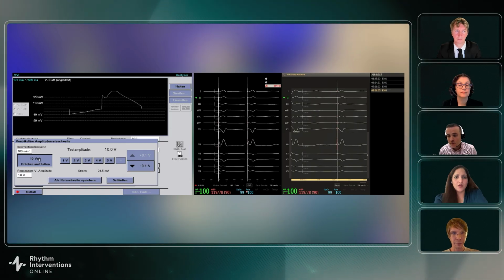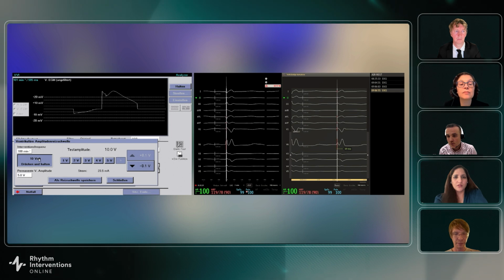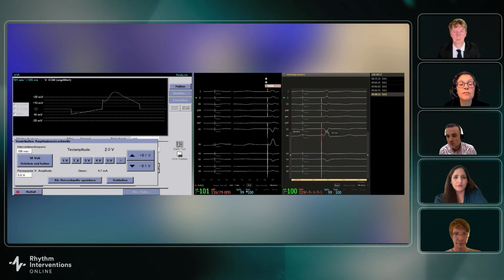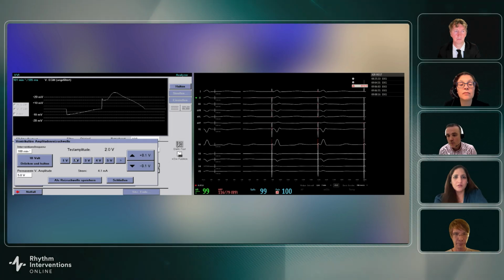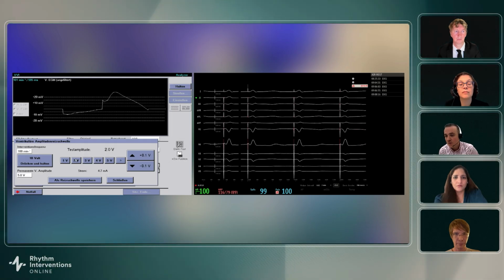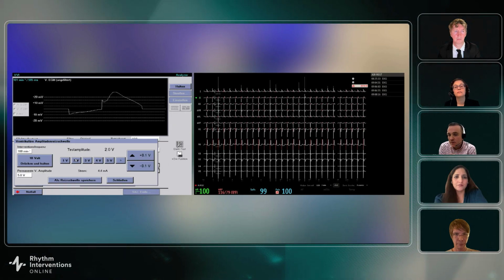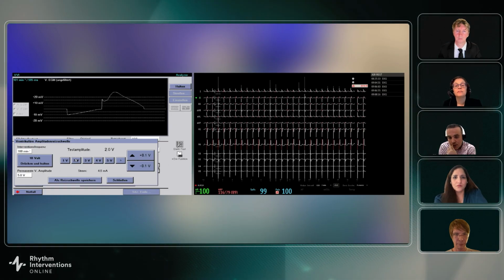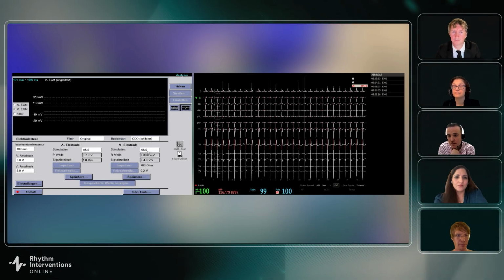And then EKG wise, I'm not able to appreciate it, but if you saw the transitions with higher and lower output, those are important transitions. Yes, this is a more specific sign, to be honest, to be sure that we are capturing the conduction system. And here we can see the QRS duration looking at the speed of 25 millimeters per second. It was really narrower compared to her native ECG.